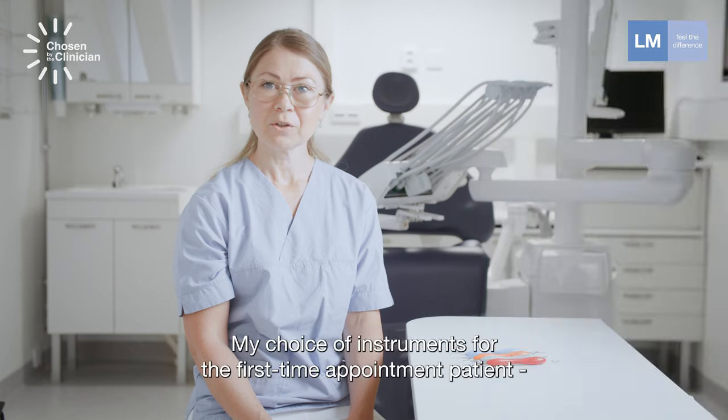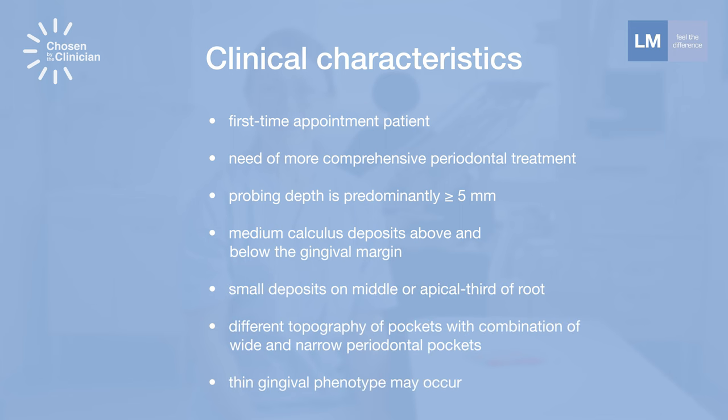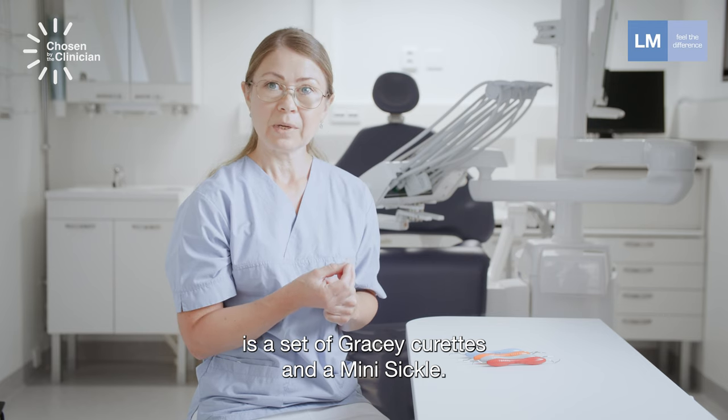My instrument choice for a first-time appointment patient with the need for more comprehensive scaling and pockets more than five millimeters, with calculus deposit size from small to medium, sometimes with different root topography, is a set of Gracey instruments and a mini sickle.